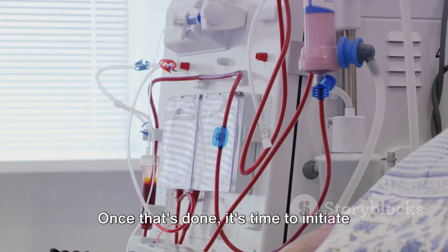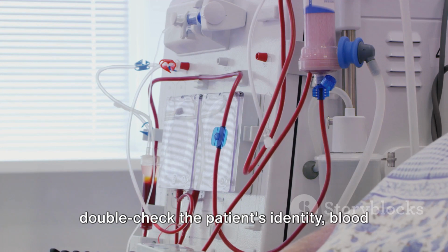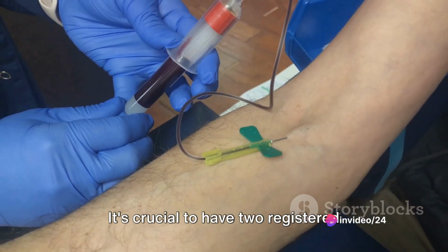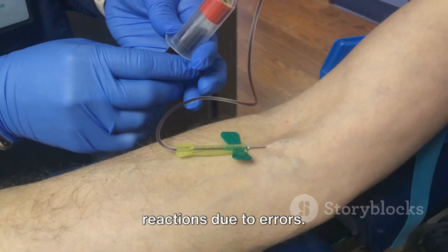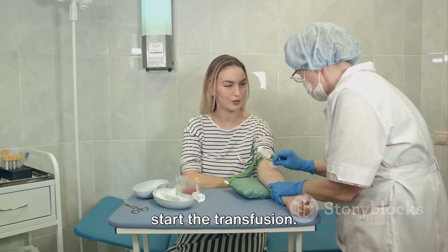Once that's done, it's time to initiate the transfusion. But before we do that, we need to double-check the patient's identity, blood type, and the blood product. It's crucial to have 2 registered nurses present during this step to cross-check all the details. This is to prevent any transfusion reactions due to errors. After all checks are complete, we can start the transfusion.